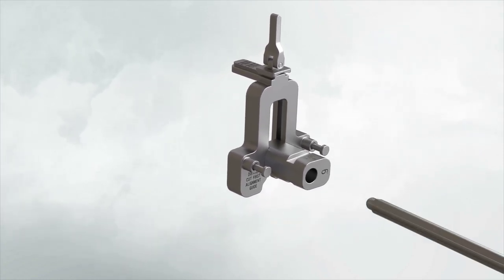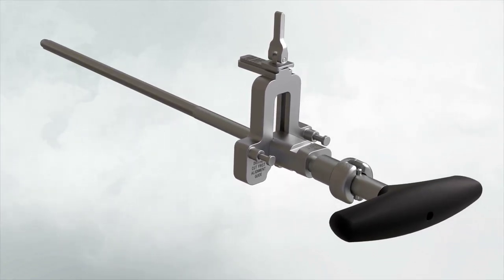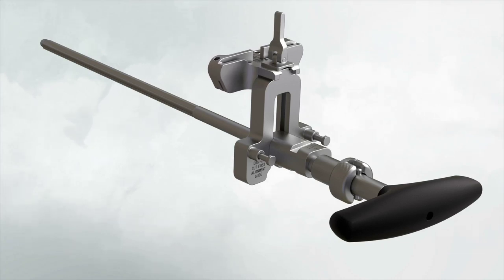Attach a modular T-handle to the IM rod and insert through the alignment assembly. Assemble the distal femoral cutting block onto the valgus alignment guide. Positioning the block at the primary resection level will ensure the cut will equal the distal medial thickness of the femoral prosthesis. Lock by pressing the lever in a horizontal position toward the medial side.